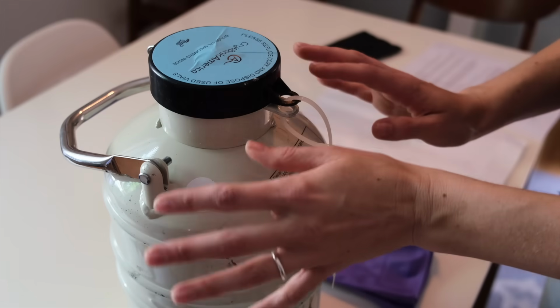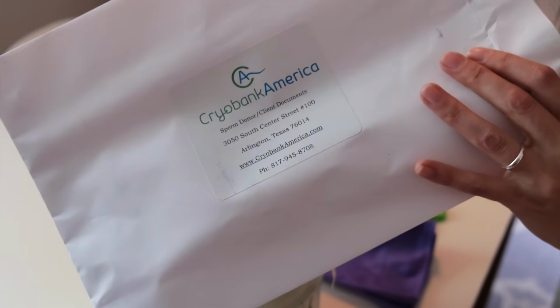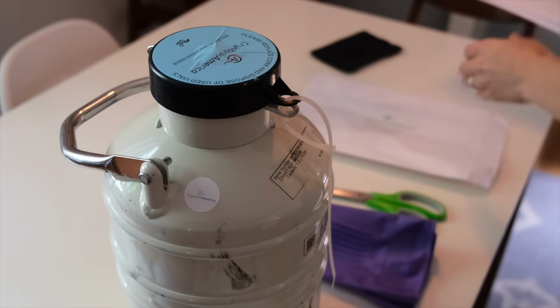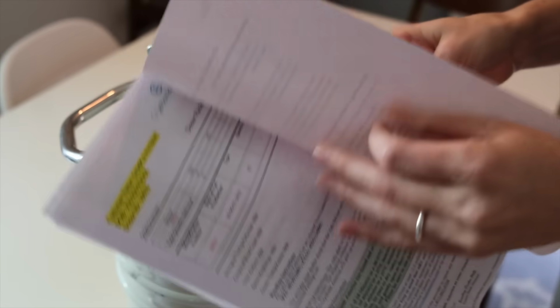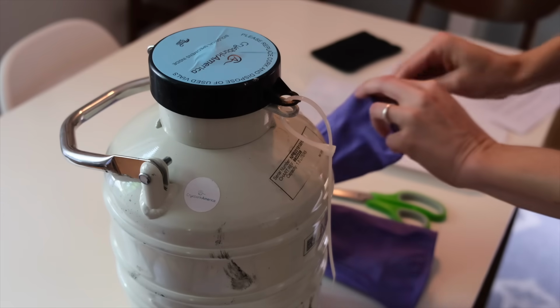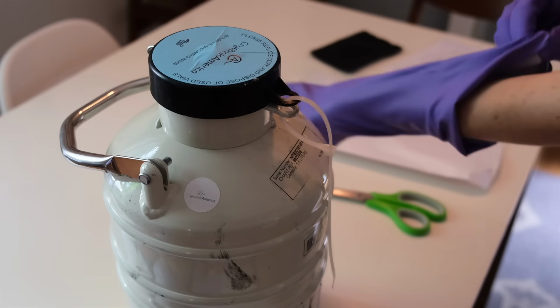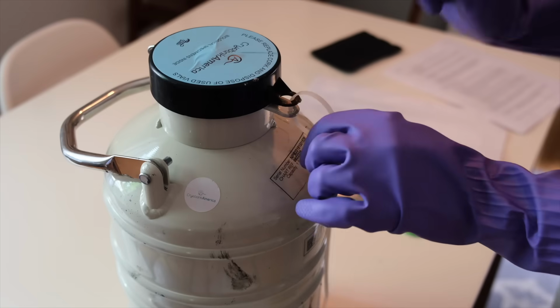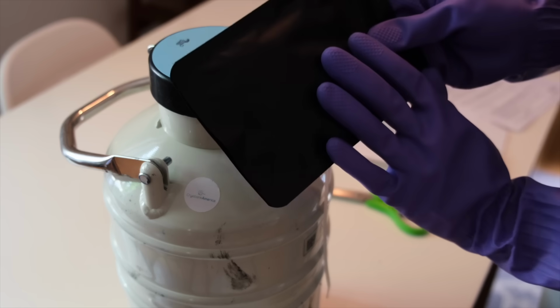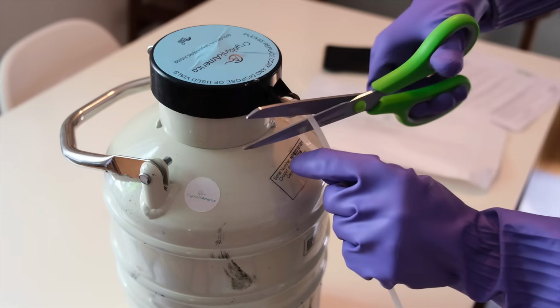Okay, so we've removed the contents from the shipper. You'll have your cryo tank, which is here, and you'll have some paperwork in the envelope, which includes a return label to ship it back when you're ready. You'll also have your instructions for thawing and your donor information. Ours is a sample today because Cryobank has prepared us a sample. I have some gloves that I'm using to open up the cryo tank that I got from our local grocery store. You'll be able to use any sort of latex gloves or the gloves that come with the cryo tank as well. So we're going to cut open the zip tie here.